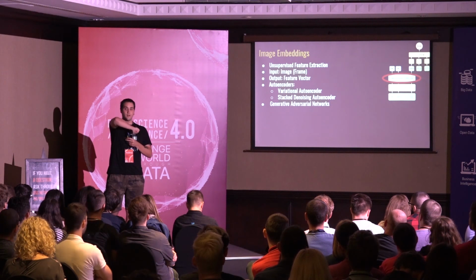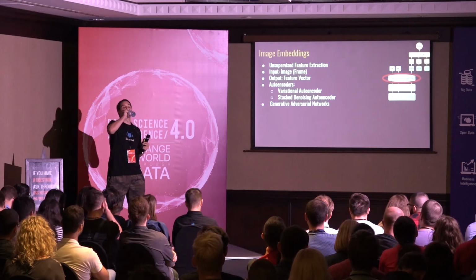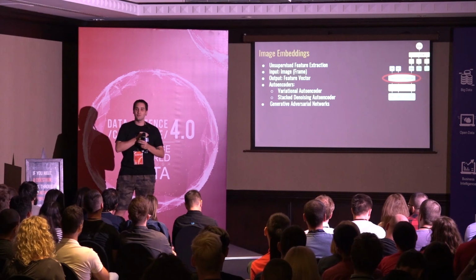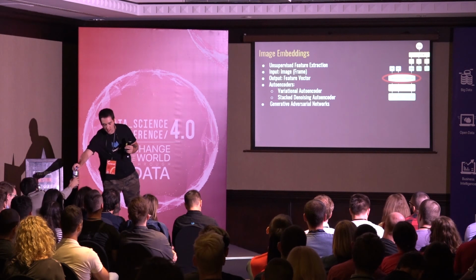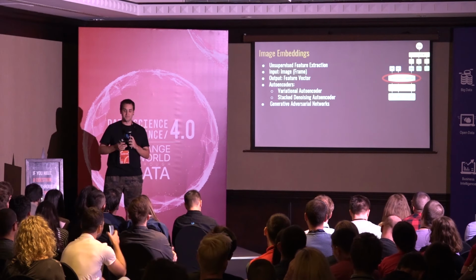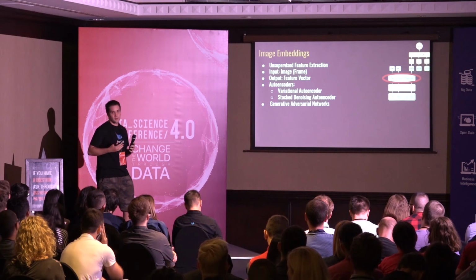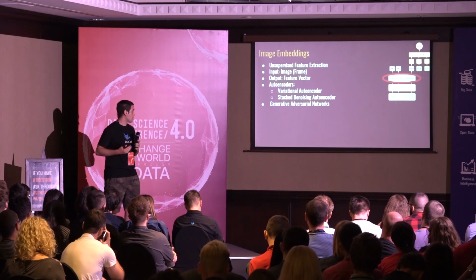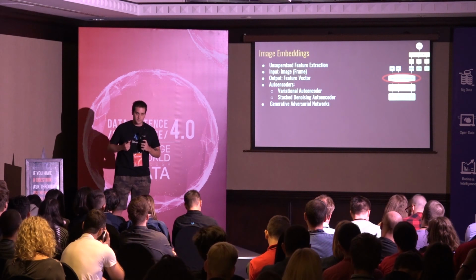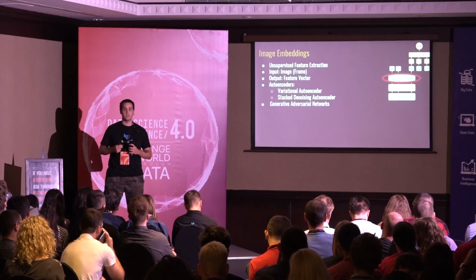We chose an unsupervised feature extraction technique because we have both labeled and unlabeled videos. So we want to take advantage of all the unlabeled videos. An unsupervised feature extractor doesn't require labeled data. So as input, we will bring some pre-processed embryo, and as output, we will get some feature vector that represents this input.